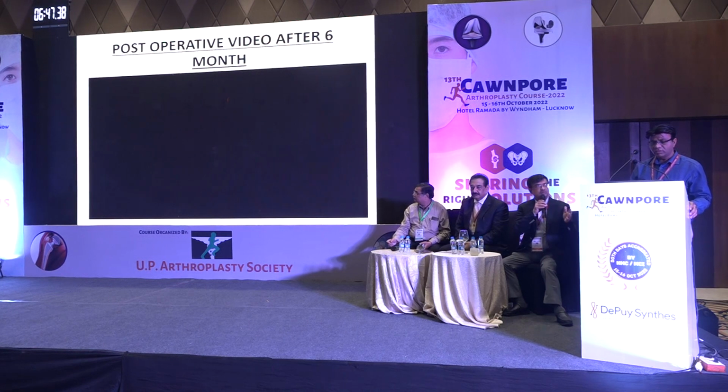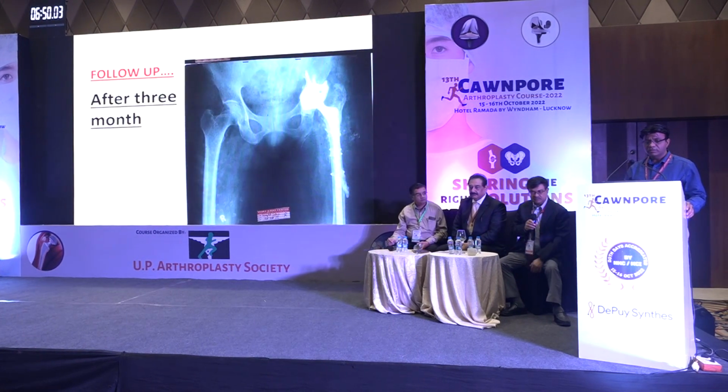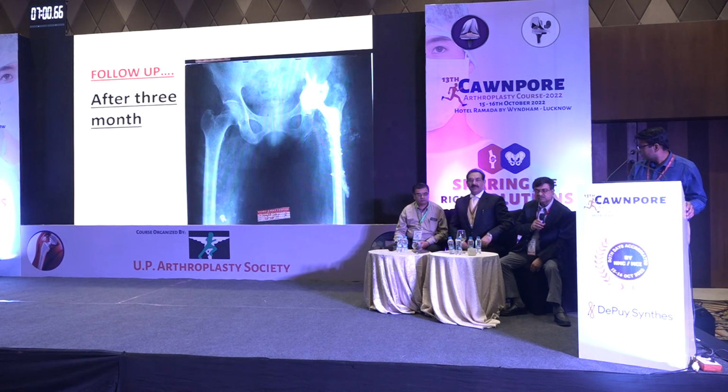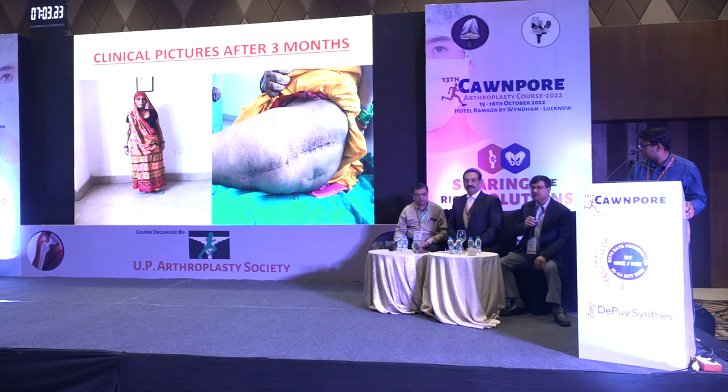Can you show the post-operative X-rays? Just the post-op one. Immediate post-op and then 1, 2 months and 6 months. This is after 1 month. 2 months. 3 months. This is after 6 months. And I have used the posterior approach in this case.